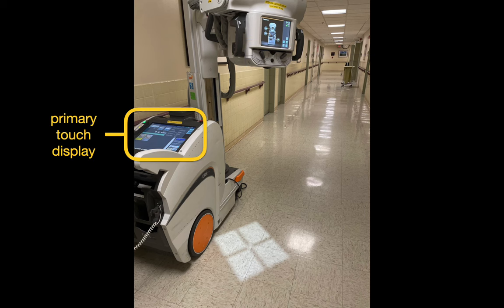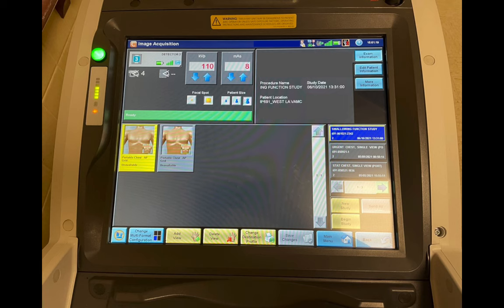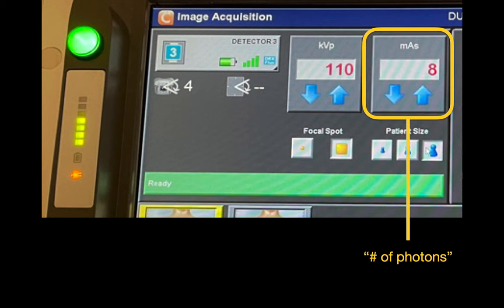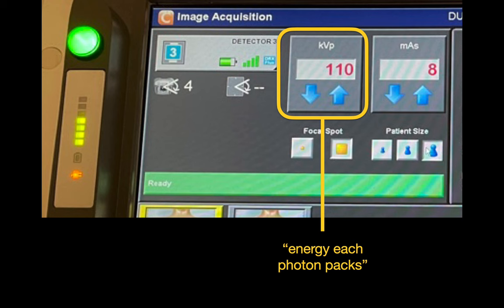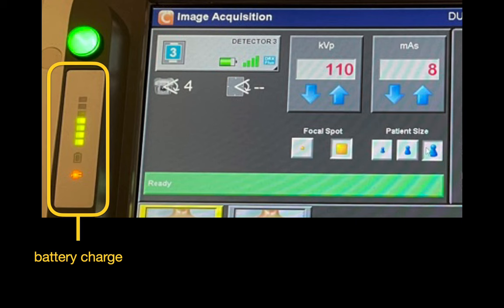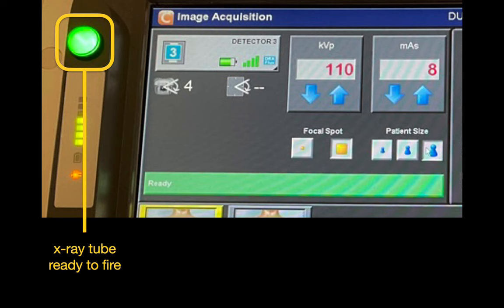There's a large touch display on the console of the unit. Most of the important controls are in the upper left corner. This is where we adjust the x-ray tube current and exposure time. This is where we adjust the peak x-ray tube voltage. There are some presets for small, medium, and large patients. Since this is a portable x-ray unit, we've got a handy battery level indicator, and a round green indicator lamp lights up when the capacitor that powers the x-ray tube is charged and the tube is ready to be fired.